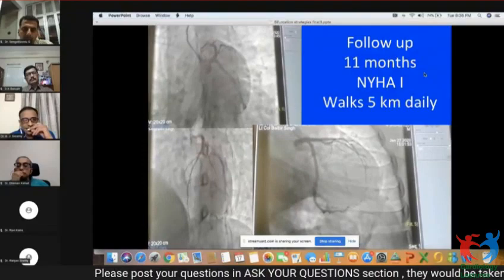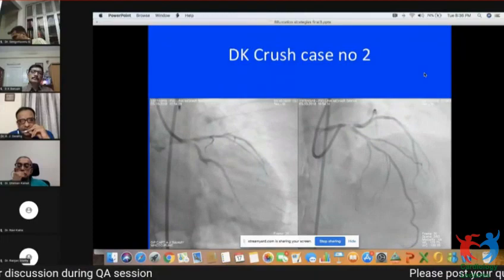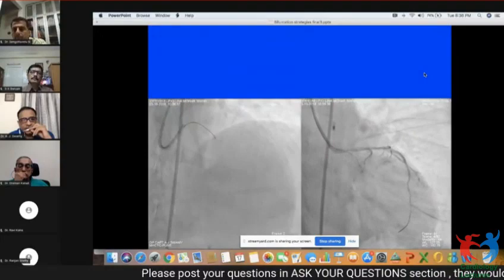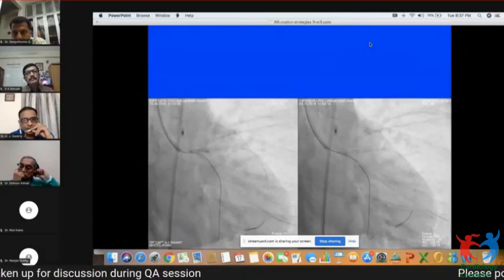This is another patient, I don't remember his age, but he's got almost a complete occlusion of the left main, which is heavily calcified. Worsening angina, again with an IABP in place. This is the first wire being placed. Then the circumflex, which was a little more difficult to wire, was done with our XTR wire. Thereafter, both are pre-dilated and prepared well with cutting balloons.